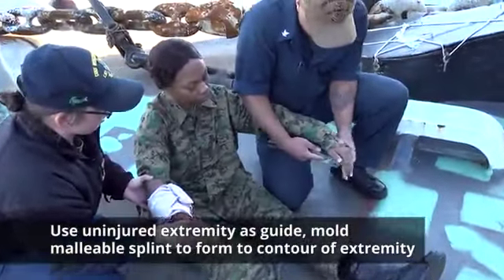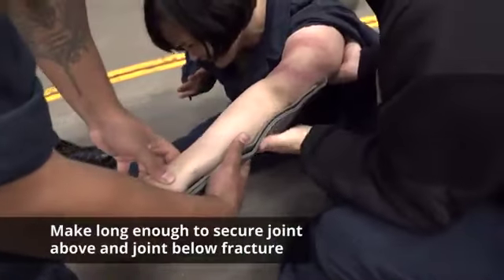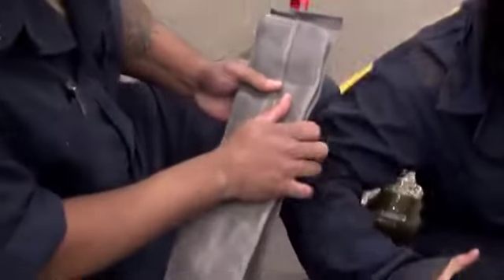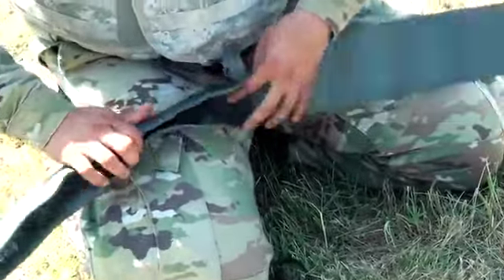Using the uninjured extremity as a guide, mold a malleable splint to form to the contour of the extremity, making it long enough to secure the joint above and the joint below the fracture. Occasionally, this will require two malleable splints secured together with wraps or tape. Malleable splints gain their rigidity by introducing curves and folds, particularly along the long axis of the splint.